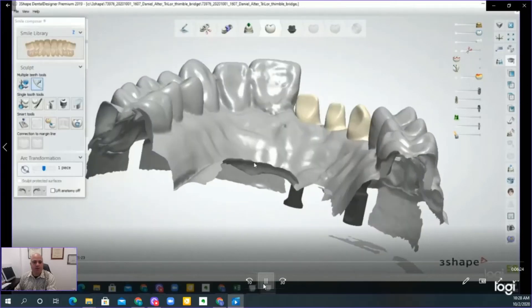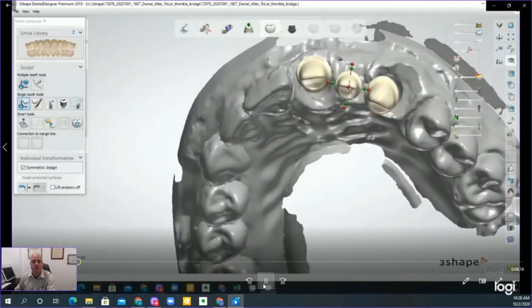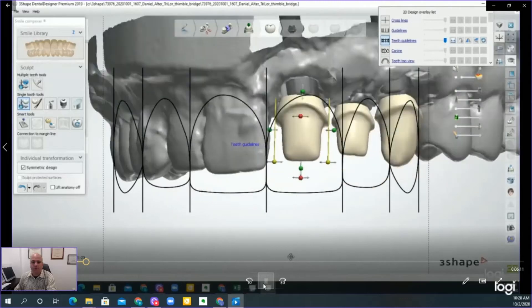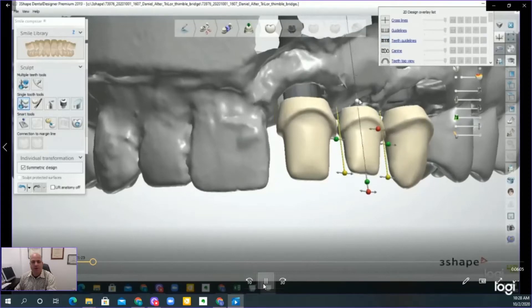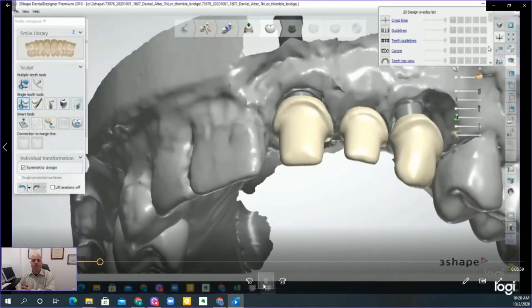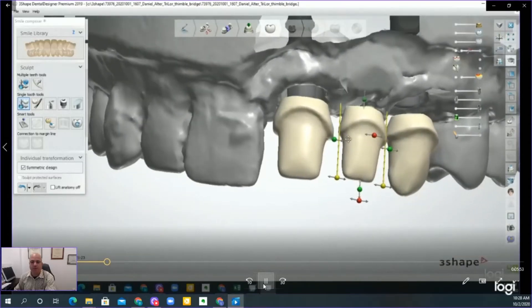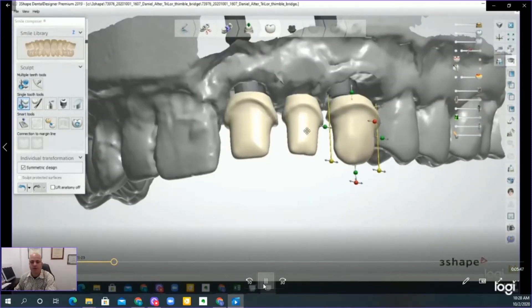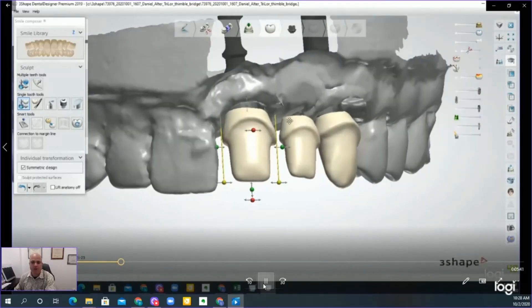You can see here in the library there is a Trilor Thimble library. We now have all 28 restorations — all 28 thimbles that you can utilize. It's fully adjustable and allows you to make your adjustments. Here, we're looking for the margin line to coincide with the adjacent teeth. As you're setting it up, these margin lines need to align because this is about a millimeter of reduction, which will allow you to subsequently make crowns over this Toronto-style, thimble-style implant-supported bridge.